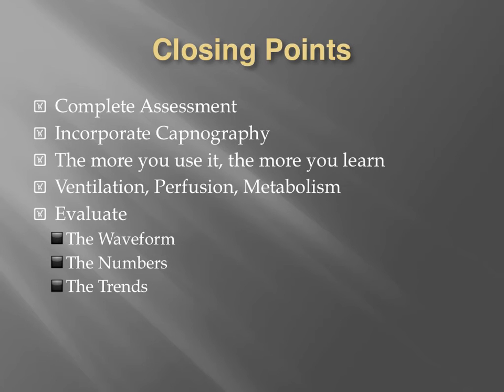When we're incorporating capnography, we have to do a complete assessment. We don't just look at capnography for itself, but we look at the whole patient and look at all of our different signs and symptoms and all of our assessment skills and put it all together to come up with a more reasonable approach to how we treat and assess our patients. The more you use it, the more you learn. The more you learn, the more you want to use it.